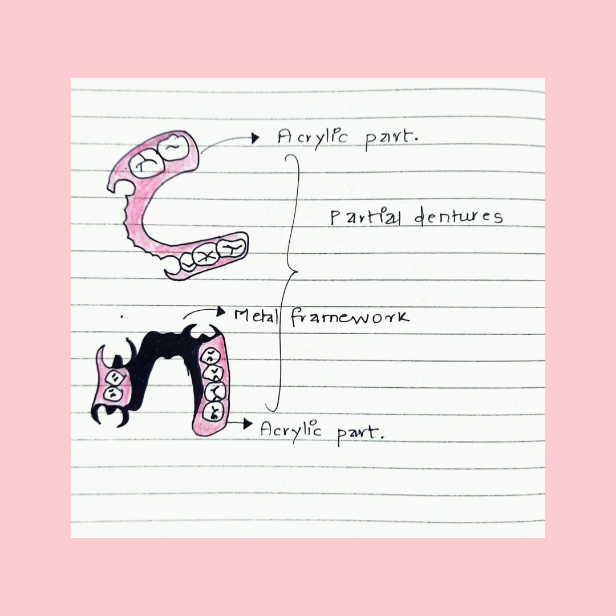In the third year or final year of your prosth postings, you might have delivered a complete denture or even a removable partial denture. What you see in the illustration is the first picture of an acrylic partial denture, where you have an acrylic part and artificial teeth on it. These are also called gum strippers because they cause gingival recession.